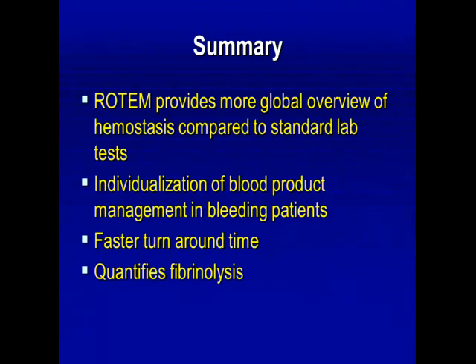The turnaround time is quite a bit faster, and this obviously depends on where you've put the machine. So you can put it at the bedside in the OR or in a centralized lab, so it'll depend on how you've set it up, because obviously there's going to be time required to porter the sample to the lab if you've decided to centralize the machine.